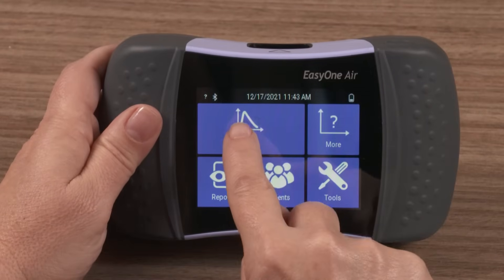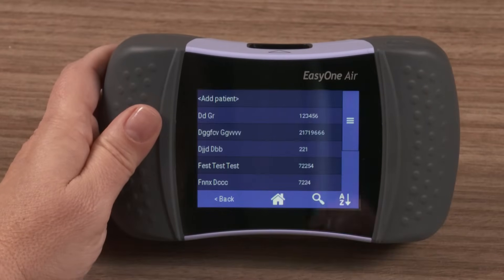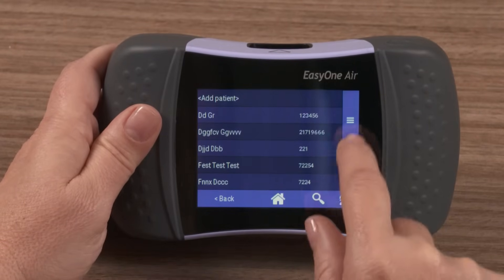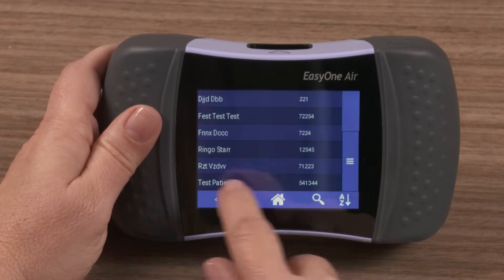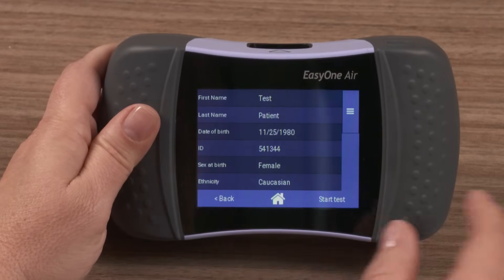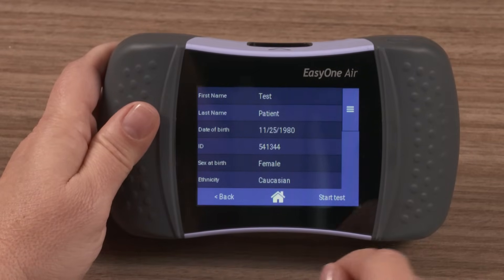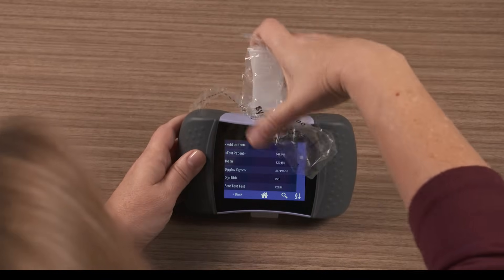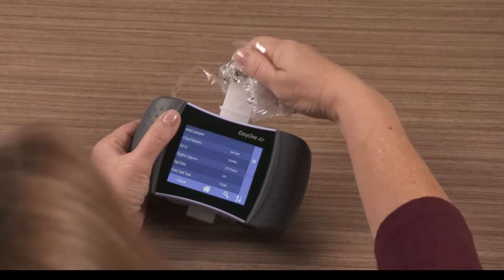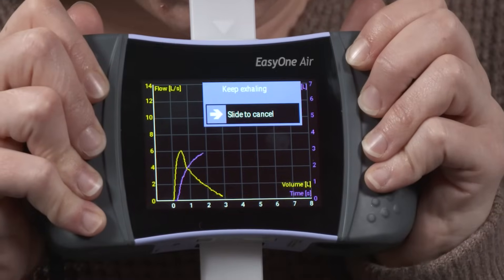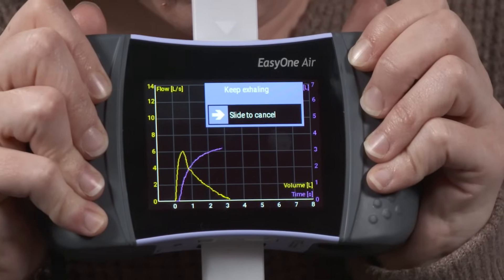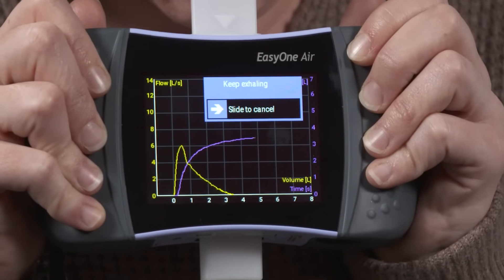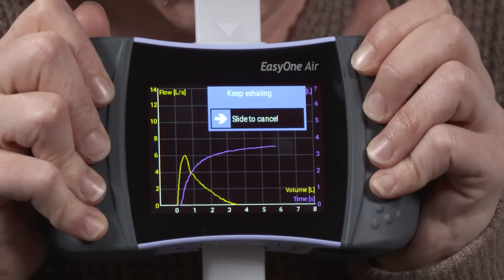We will then select either the FVC or FVL test from the EasyOne Air home screen menu. Insert and block the flow tube mouthpiece as prompted. Follow device prompts to coach the patient throughout the spirometry maneuver.